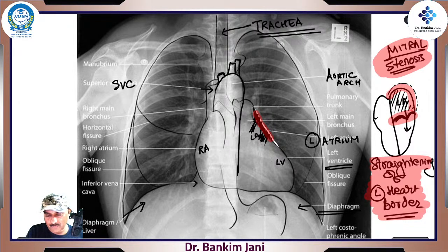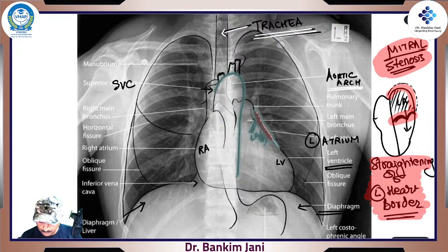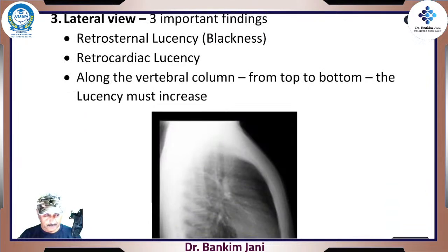But now when you watch the X-ray, the first thing you watch is the trachea center, right? Can you see the aortic arch? Is the heart in its normal shape like this, a smooth, graceful curve? This curve means the left atrium is not enlarged, nor the left ventricle. And then, can you see the dome of the diaphragm properly? Pass this much to start with.